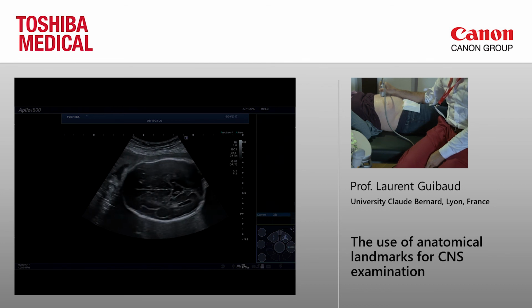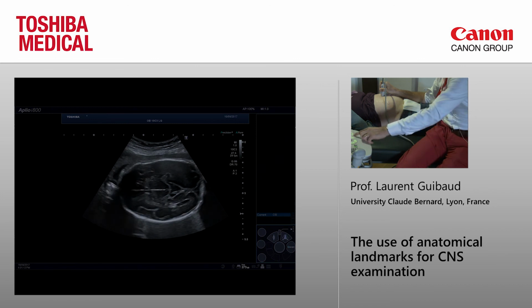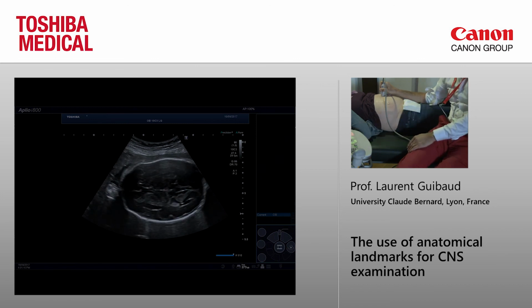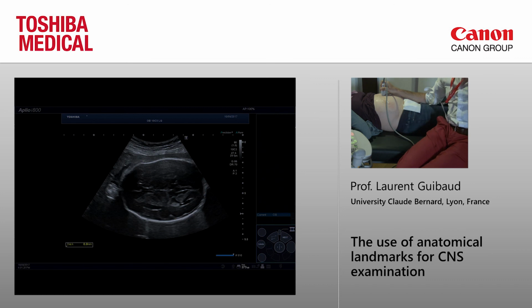In that case, you are dealing with a baby with a large head, with slight ventriculomegaly, and the main difficulty is to have an idea of how the pericerebral space looks in the normal condition. If you don't look each time at the pericerebral spaces, you will never know how they look when it's normal. And you see here the pericerebral spaces, and we have no norms.